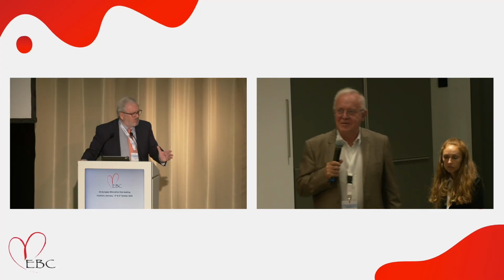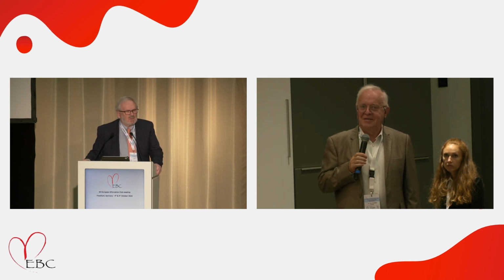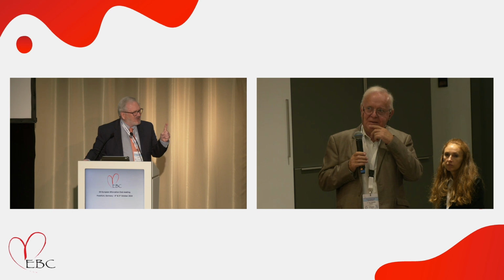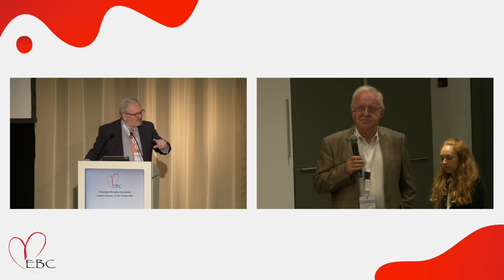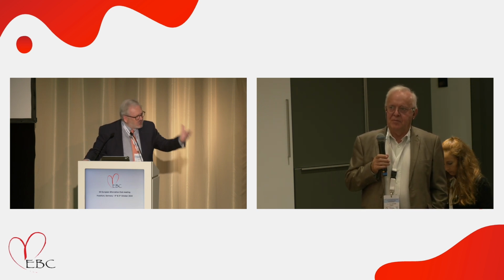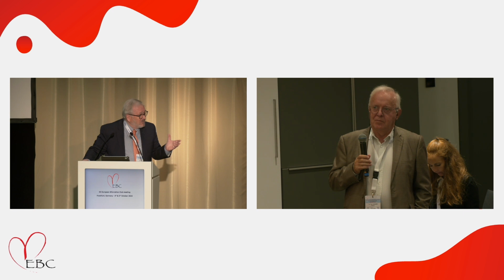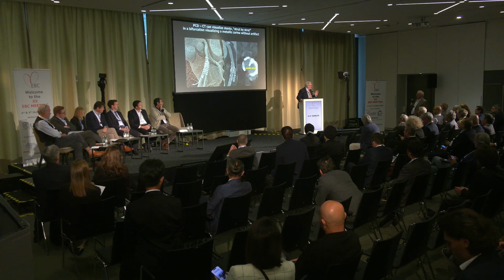No, everything will be modified. It's very simple. I mean, Carlos Collet is very aware of that. Number one, the resolution is 111 micron. That's the official resolution of the Siemens photon counting. There will be 600 at the end of the year, but GE is coming, Philips is coming, everybody is coming. Siemens has abandoned the manufacturing of their conventional multi-slice CT scan. They only make photon counting now. That tells you something, you know.